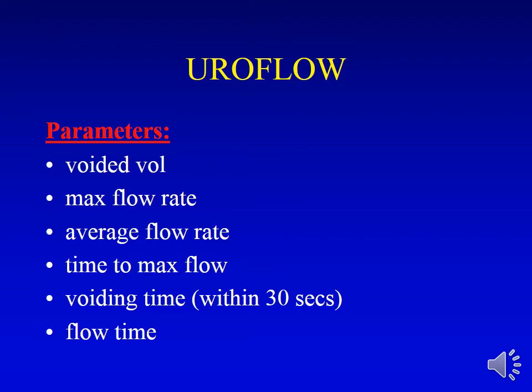So what is a uroflow? Uroflow is a basic, simple investigation done before the proper conventional urodynamic. Basically, the patient passes urine into a toilet bowl connected to a computer, and the flow is measured by the computer itself.